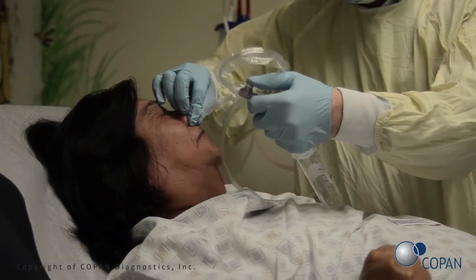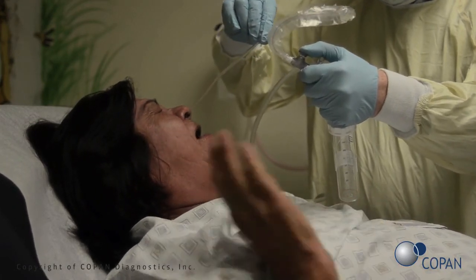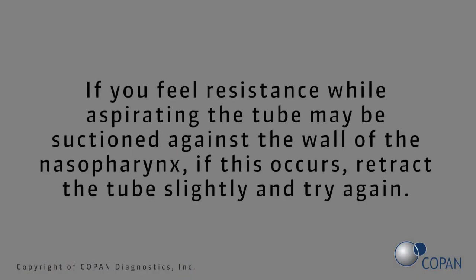Using a smooth motion, quickly push and then pull the syringe plunger to expel and aspirate the saline. Carefully remove the tube from the nose. If you feel resistance while aspirating, the tube may be suctioned against the wall of the nasopharynx. If this occurs, retract the tube slightly and try again.